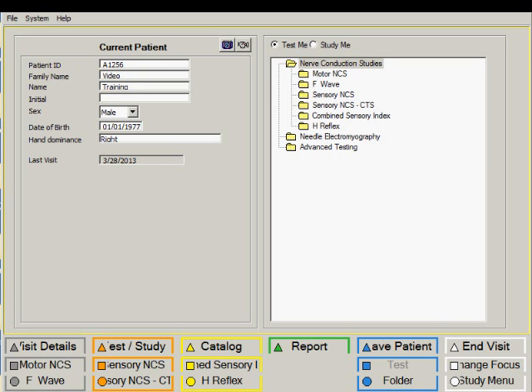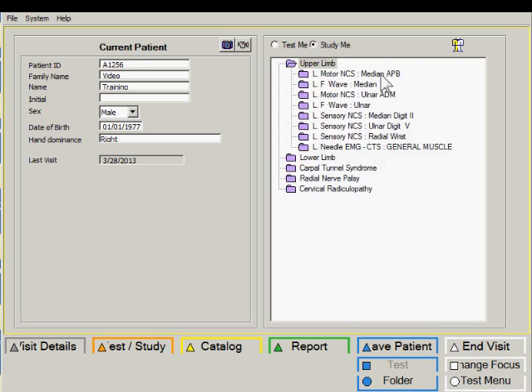To summarize, one can access any nerve conduction study in a very flexible random manner by using the test folder or one can access them by using the studies. The studies offer the benefit of having quick access to the desired test. And secondly, the study always contains all the necessary tests for making a specific diagnosis such as carpal tunnel. This ensures that all the necessary testing is adequately performed.